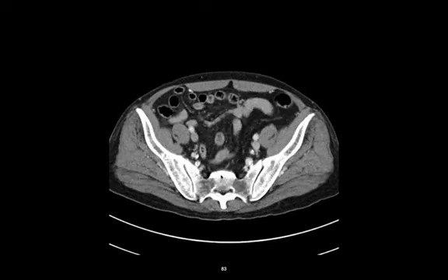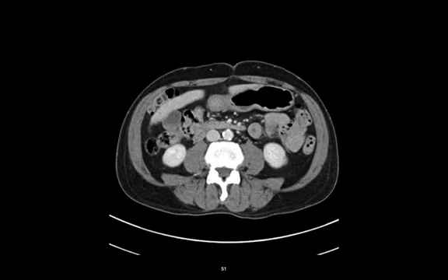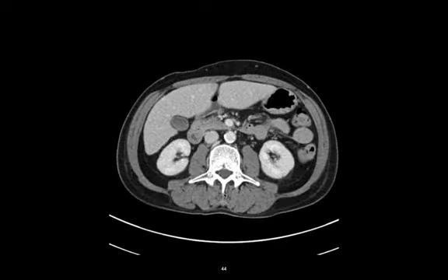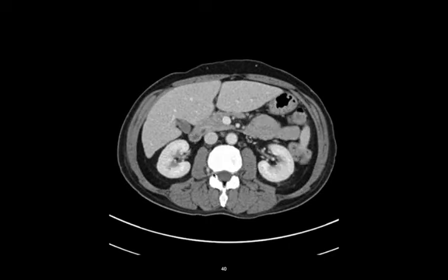Now we're going to go over basically the normal structures that we did before. Let me get a different view of this. So let's go up here and say, all right, there is a spinous process and there's a transverse process and a transverse process. The lamina on either side of this. There's the vertebral canal, a big vertebral body with spongy bone, and there's a pedicle and there's a pedicle. If we move, you're going to see the pedicle disappear because that's an intervertebral or neural foramen.